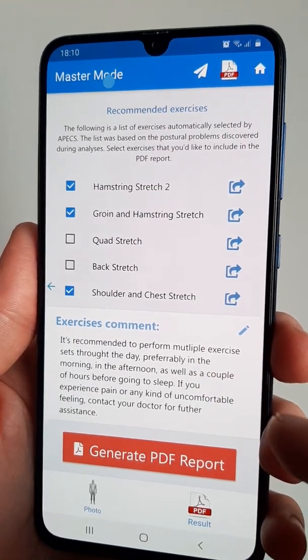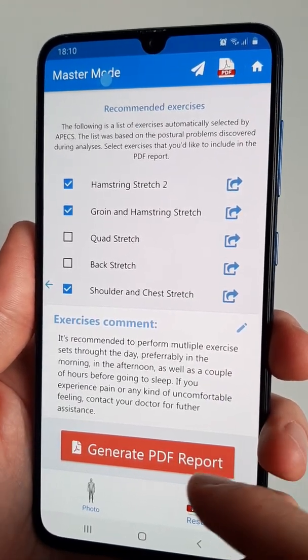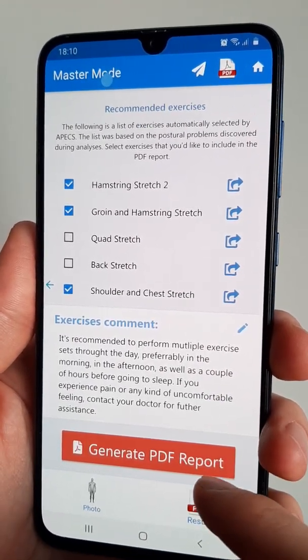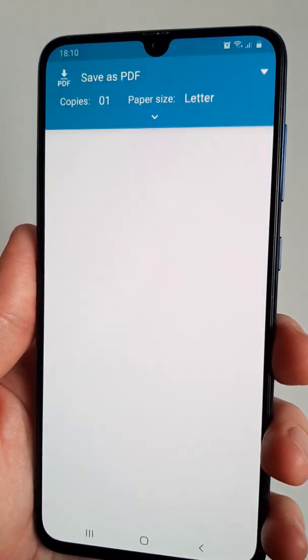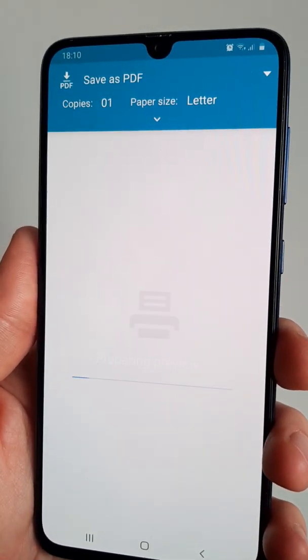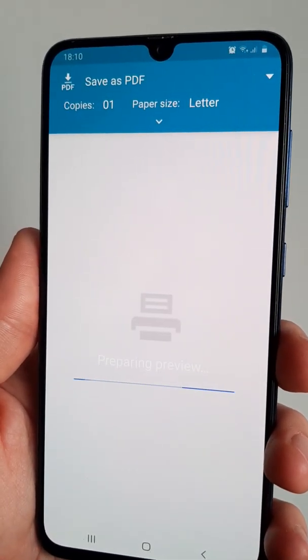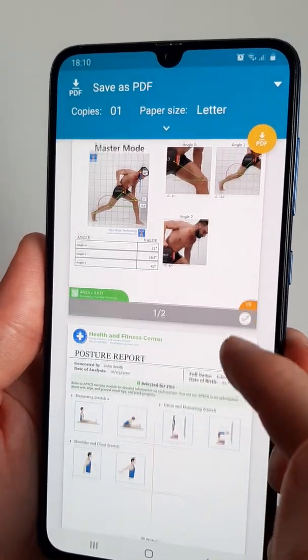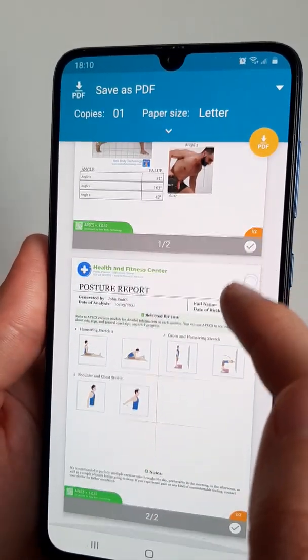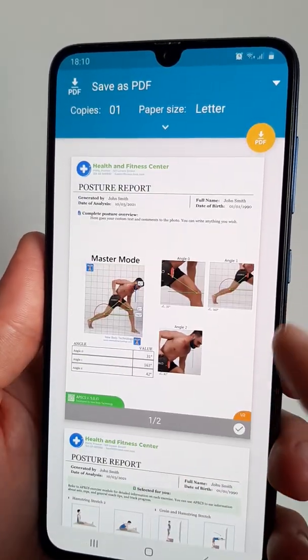Once you've finished putting in all the information needed, click on the Generate PDF report button. This will allow you to obtain one single PDF document that regroups all the information you made.